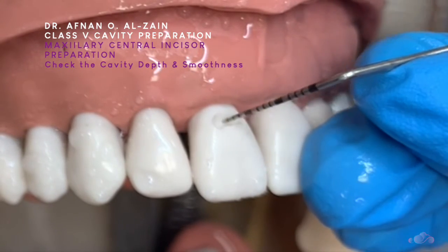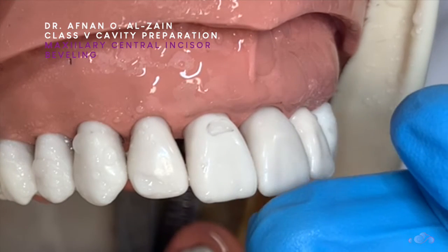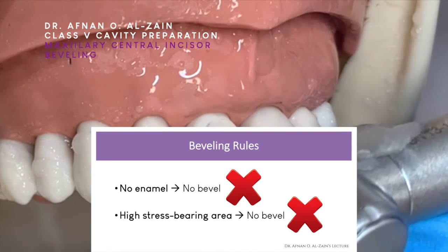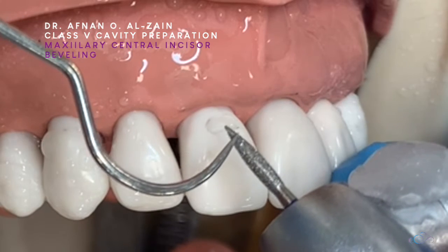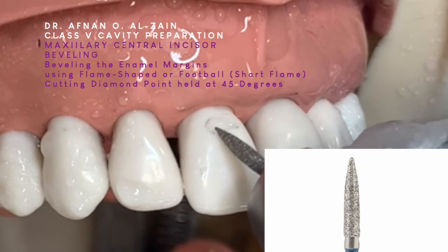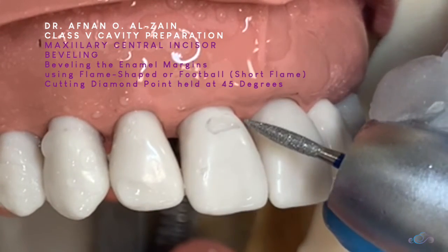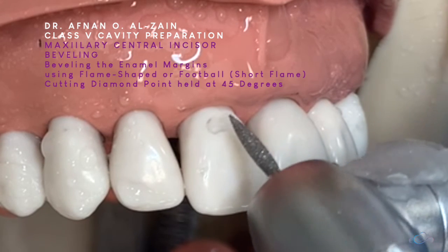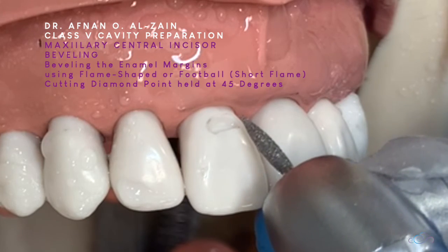The depth is about 1.5 millimeters so that we can get to the dentine. Now in class 5, because it is a non-stress bearing area, we bevel to enhance the retention. When we hold the diamond point, we're going to focus on this part at 45 degrees, and then we're going to prepare the incisal and then the proximal.